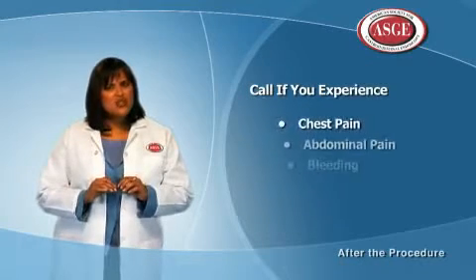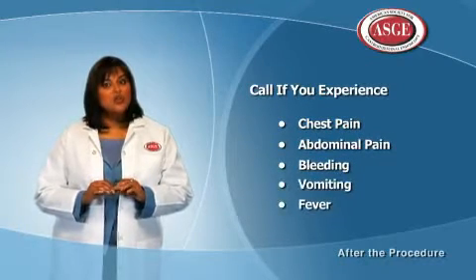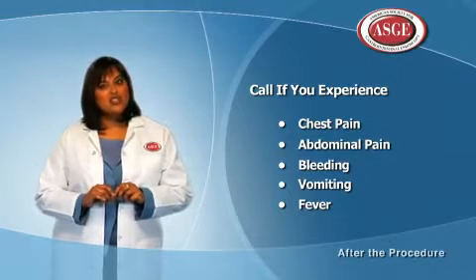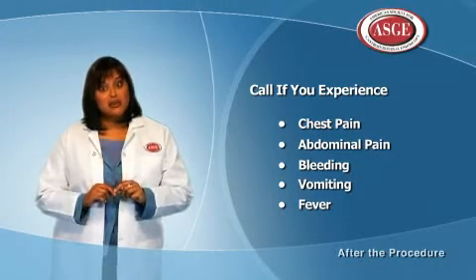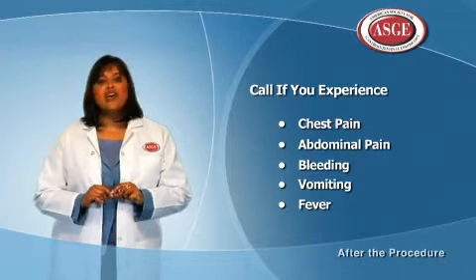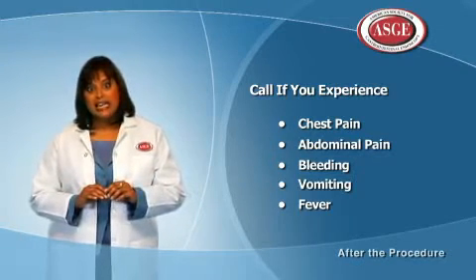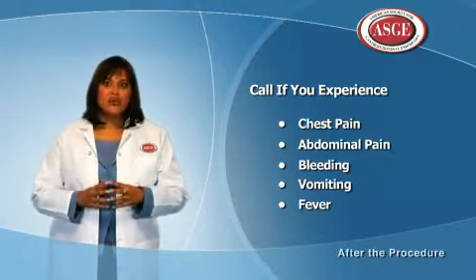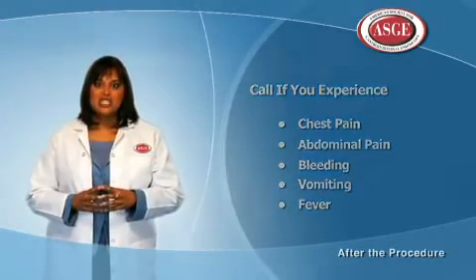Occasionally, patients have a sore throat after the exam, which usually goes away within a few hours. Although complications are rare, you will be given a number to contact your doctor if you have any chest or abdominal pain, bleeding, vomiting, fever, or if you have any other questions or problems related to the procedure.